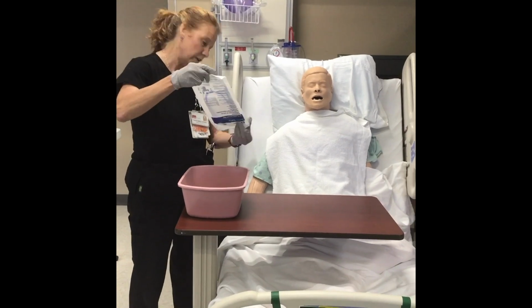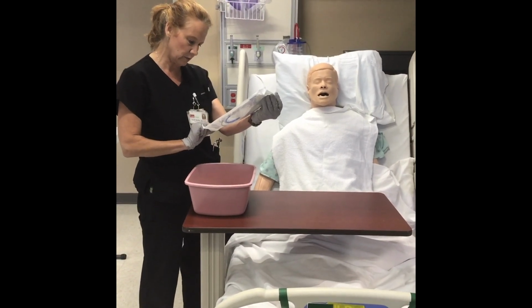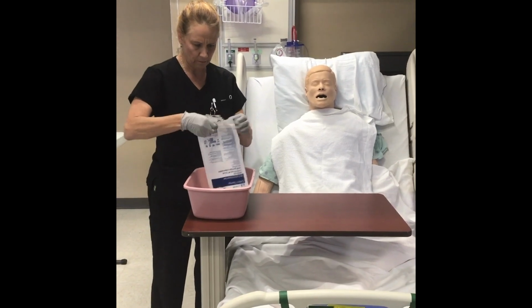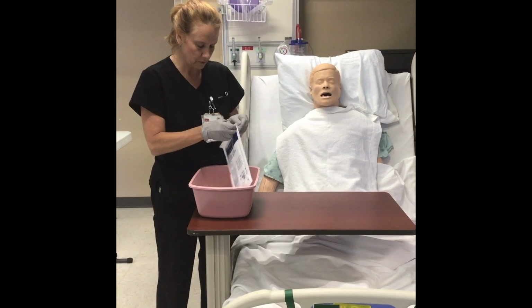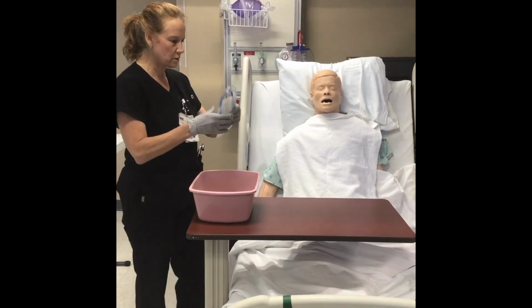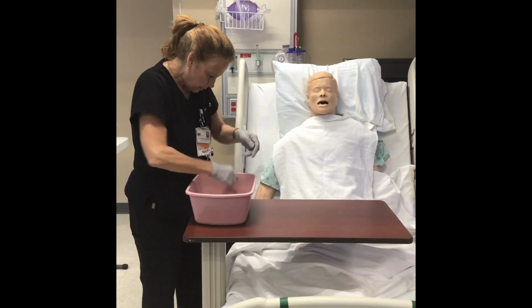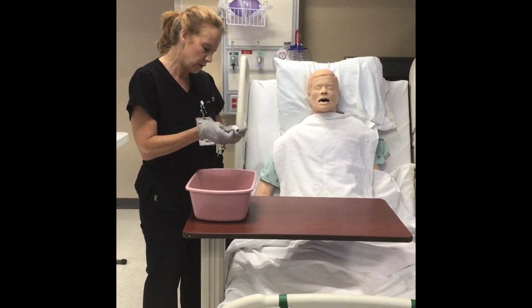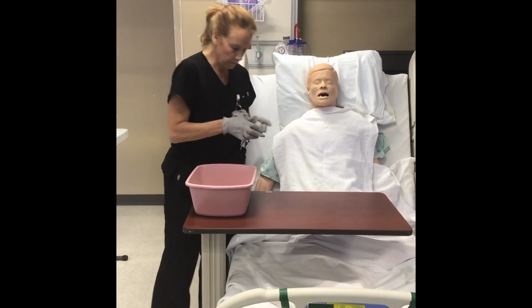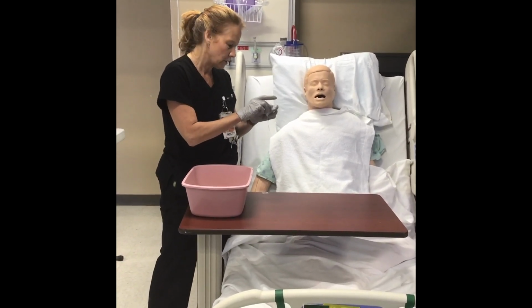So this is the NG tube that I'll be putting down your throat, and it looks like, I don't see an expiration date on here. Oh, here it is. It looks like it expires August 2020, so we're doing good on that. I am choosing the smallest device that we have just to prevent any discomfort. Okay. So now I'm going to prepare the tape, and the tape we're going to tear off 3 separate pieces of tape. And I'm just going to put them right here on the side of the table for you. Because I want to prepare all my supplies so that I'm not having to tear tape during the process.